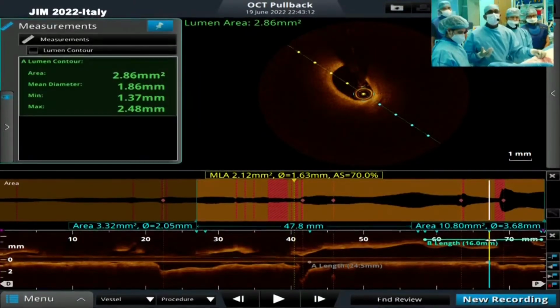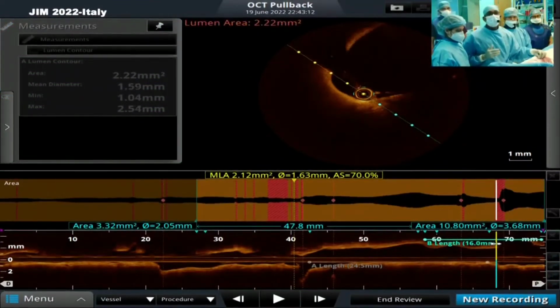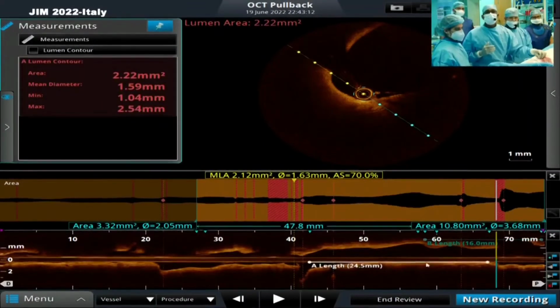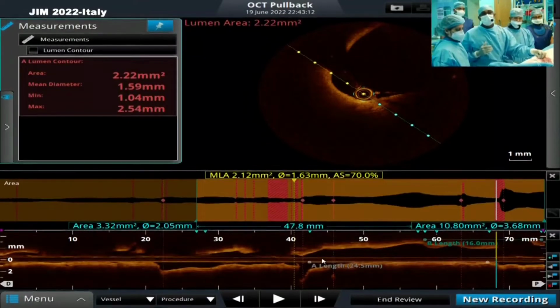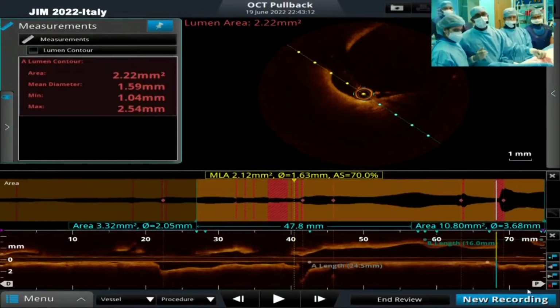Would you really want to position it right at the ostium of the LAD? It's like from 70, quite frankly, until like 40. So it's about 30. Yes, it's around 24 for sure. So a 38 stent might be able to just cover the whole thing and spare the left main.